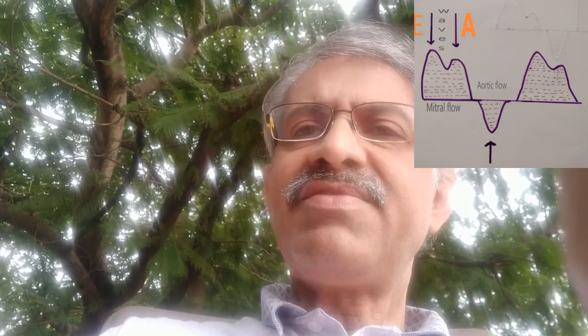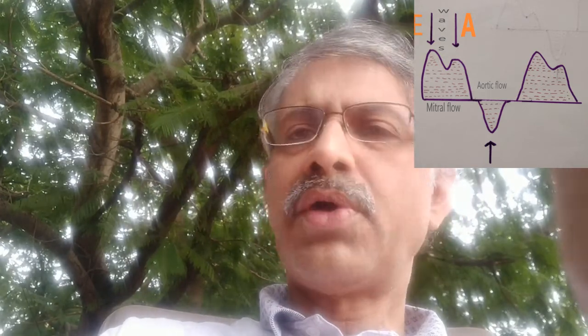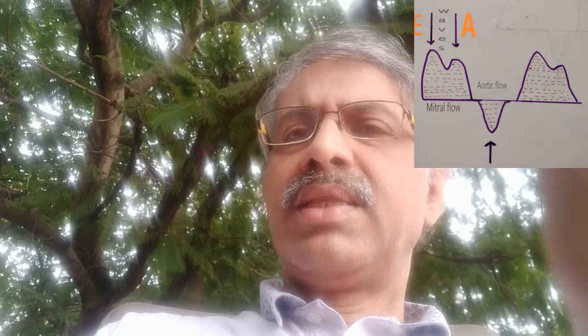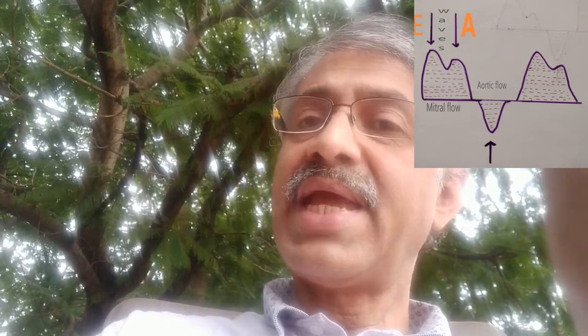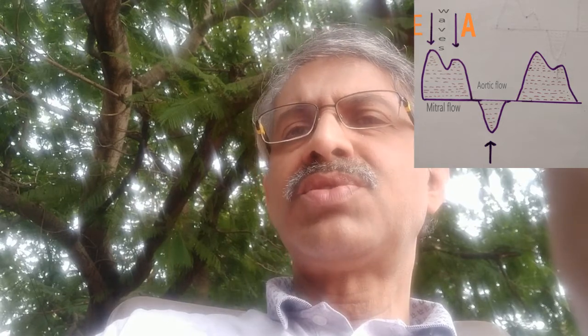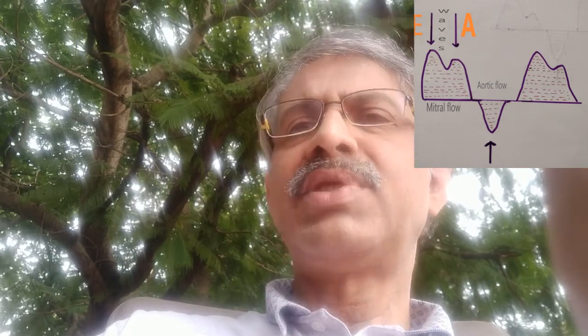The E stands for early phase filling of the left ventricle, not requiring atrial contraction. The late phase filling of the left ventricle requires the atrial contraction. That stands for A. In neonates, there are 3 important scenarios one should understand before the interpretation.